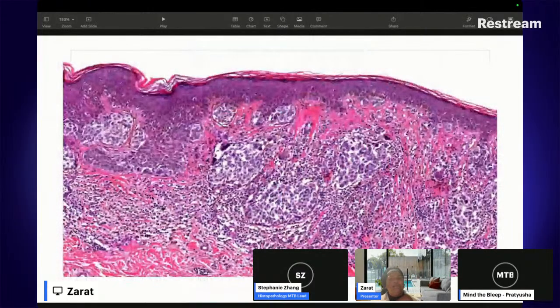And again, if you use your format, so keratin looks fine. Where is the abnormality? It's in the epidermis, but it's also in the dermis, if you look at it. So melanomas can be related to sun damage, but there are also melanomas which don't arise from sun damage at all. So that is not necessarily a helpful factor when we are looking at a melanoma. And which cells, of course, are nice clearing. You can see the nice clearing around the nuclei. Our melanocytes are to blame.